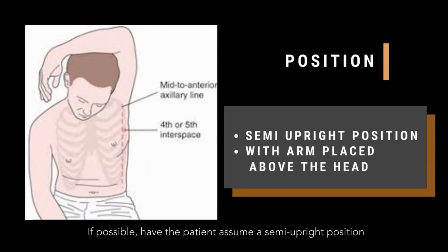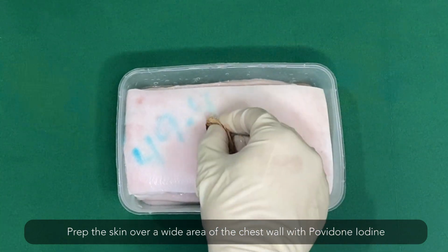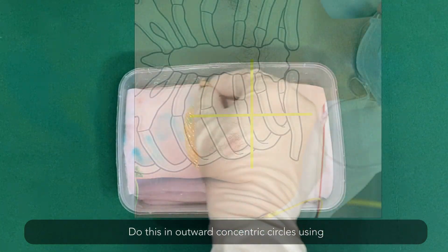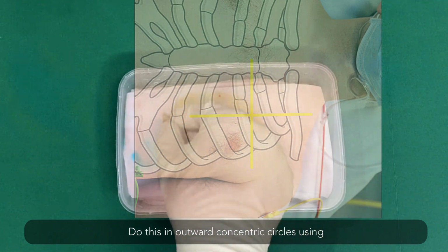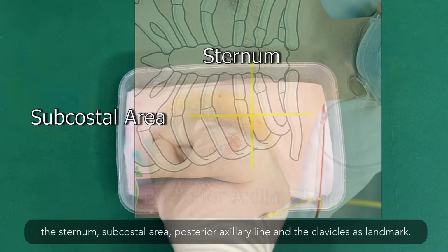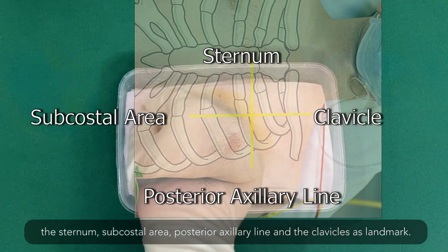If possible, have the patient assume a semi-upright position with the arm placed above the head. Prep the skin over a wide area of the chest wall with povidone iodine. Do this in outward concentric circles using the sternum, subcostal area, posterior axillary line, and the clavicles as landmark.